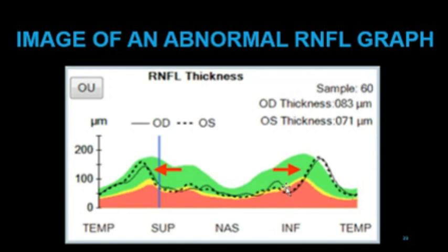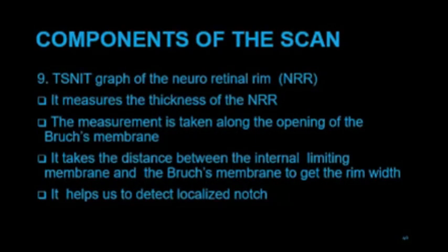And also, if you see the right eye too, it entered too, right? Yes, sir. But it didn't enter here. So for both eyes, inferiorly, something is going on here. Do you understand? Okay. Let's go to the next component.